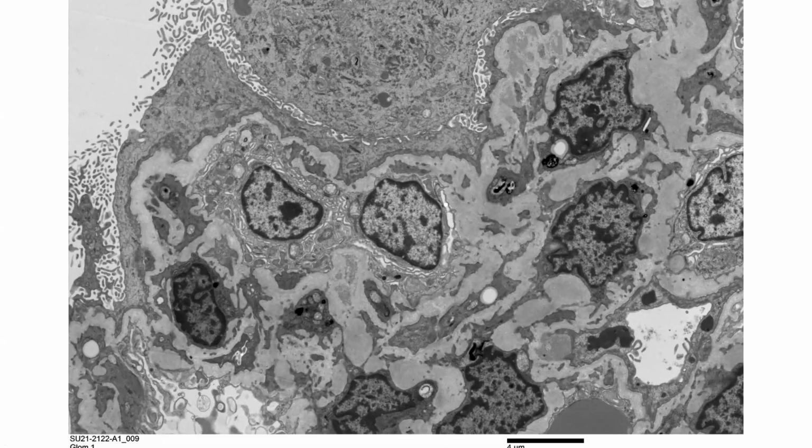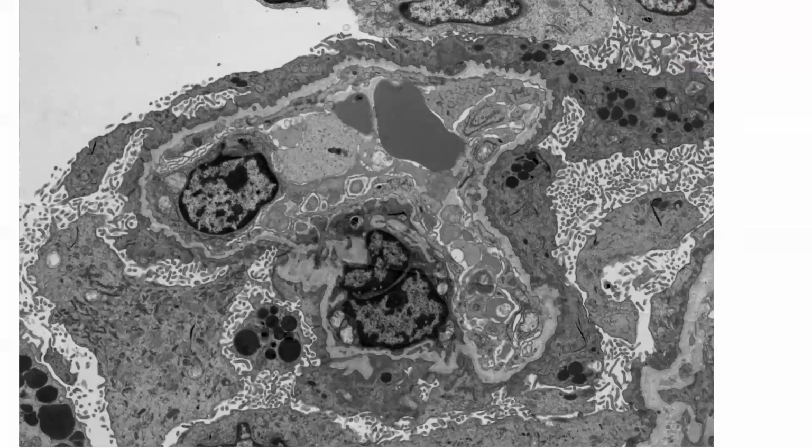That would be IgA would be a good suspect here too, right? Yeah, for the concurrence with thin basement membrane like disorders, as those tend to travel together. Yeah, they have a higher coincidence. So at least in thin basement membrane disease, the most common concurrent glomerulopathy or glomerulonephritis is actually going to be an IgA nephropathy. And so here these deposits are suspicious for immune deposits. And I think, thinking about the crescents or crescent-like lesions you're seeing, that could be one potential explanation. Oh, super interesting. Yeah, that's a very good point.